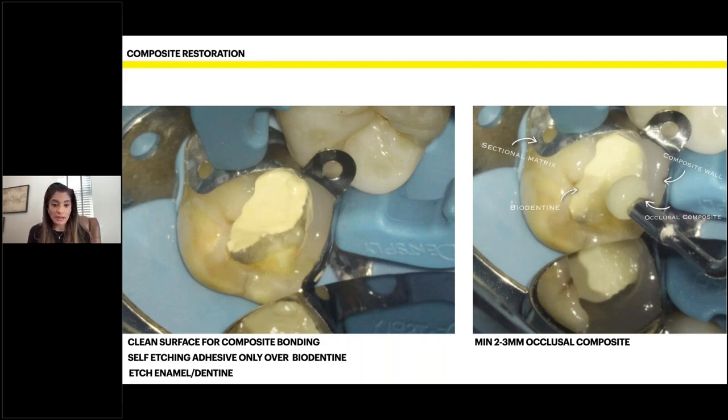I've actually modified the way I do things a little bit more since this procedure. You can see here that I had full caries removal before I built the marginal ridge up. The problem with doing that is I could have caused an exposure, and then I would have had a real problem building that outer marginal ridge up again because of that exposure. So what I tend to do now is remove all caries around the cemento-enamel junction. Don't go anywhere near the pulpal area. Build that ridge up first, and then carry on with my caries removal over the pulp. And that way, if I end up with an exposure, it's already a full-walled cavity, and I'm not having to do that delicate etch bond step in between.